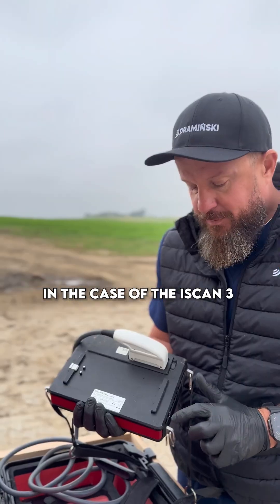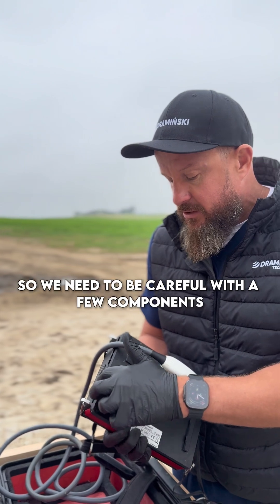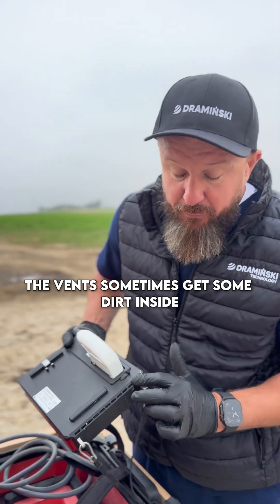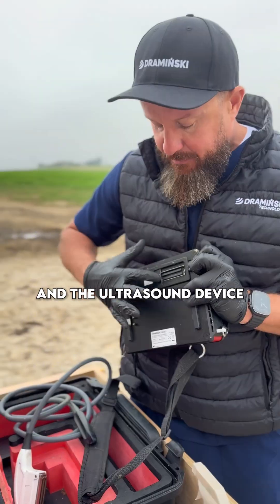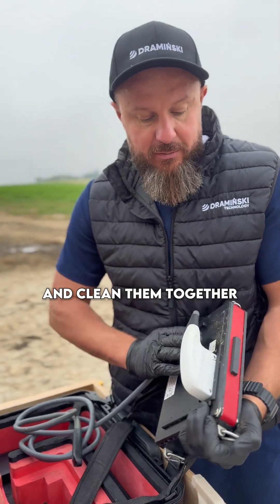Clean the ultrasound machine with me after work. In the case of the iScan 3, it is not waterproof or water resistant, so we need to be careful with a few components. The vents sometimes get some dirt inside. Another element that is not waterproof is the connection between the probe and the ultrasound device. I usually cover it with the flap, or we leave the probe attached to the machine and clean them together.